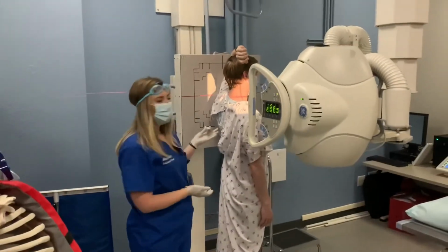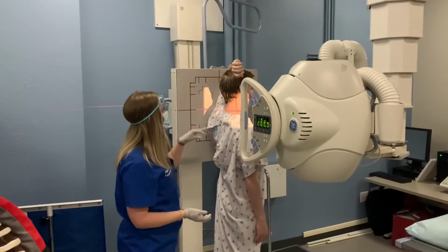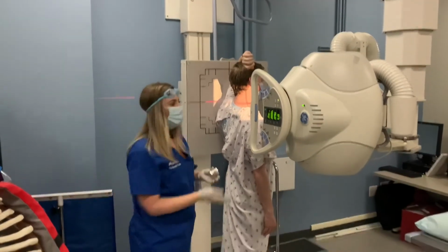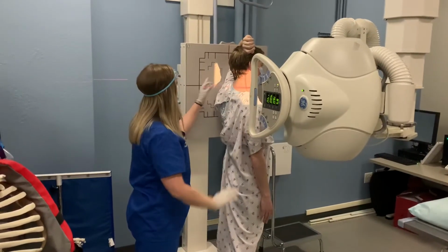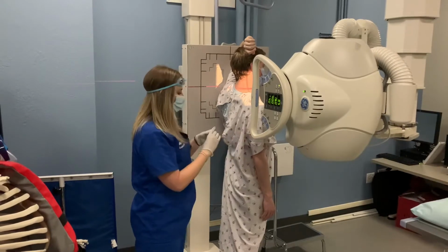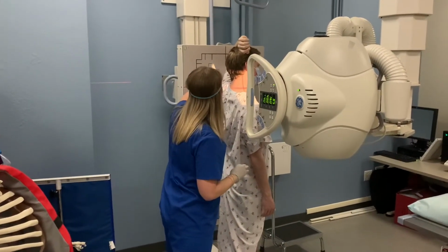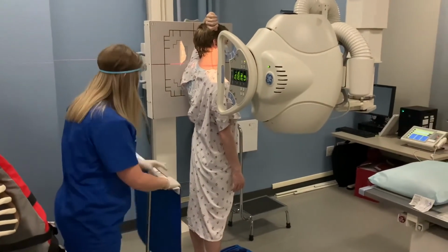Now that our patient is in position, our last couple of steps with positioning, we just want to make sure our collimation is good. It's a 10 by 12 collimation. We can bring it in just a little bit since we don't need that much light in the back of the neck. And then we're going to place a marker in the collimated field of view. And then before we head to do our technical factors, we're going to place a shield to shield the gonads.